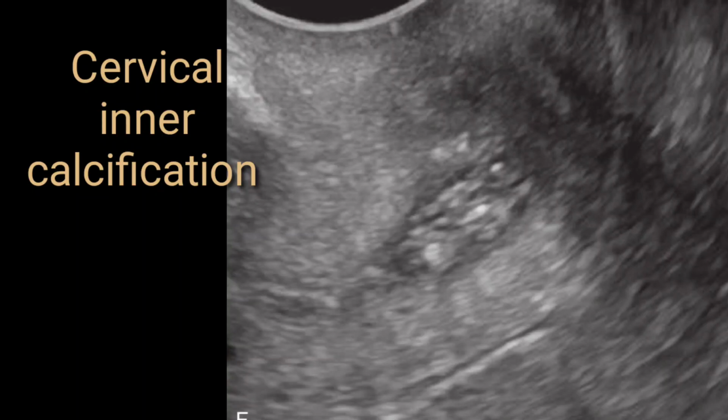But in case the patient is symptomatic and mucosal discharge is very high, then possibility of any infection may be considered. On this scan, you can appreciate the cervix and cervical canal is slightly extended. Mucosal proliferation can be seen, and beside this, tiny calcific foci can also be seen. So this is what normally you can appreciate. But if the calcific foci are more or numerous, and there is thickened fold and thickening of mucosa, then this could be pathological.